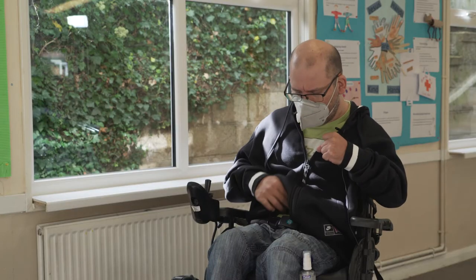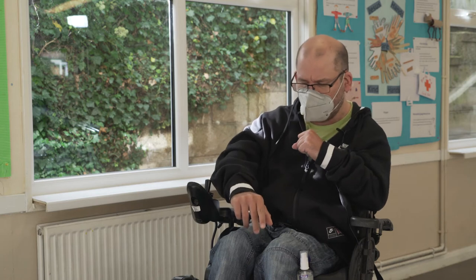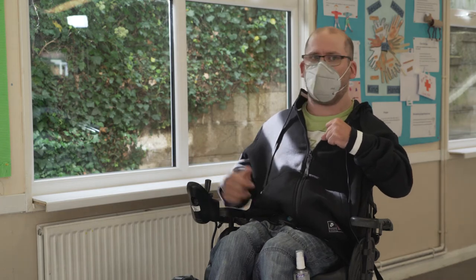We all need to make sure that we're wearing our seat belts and, if needed, our feet are strapped in. It is very, very important that when you're not using your powered wheelchair, you turn the power off.